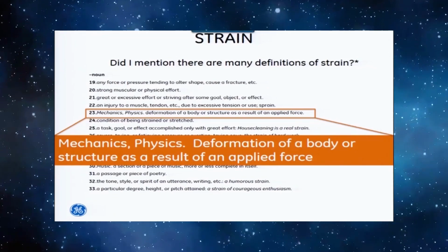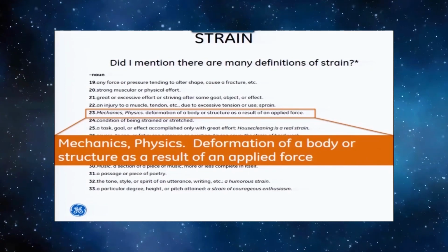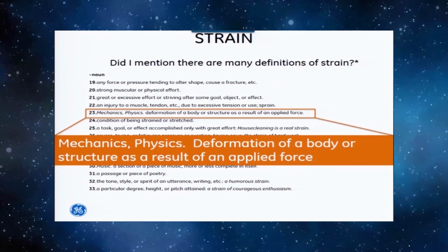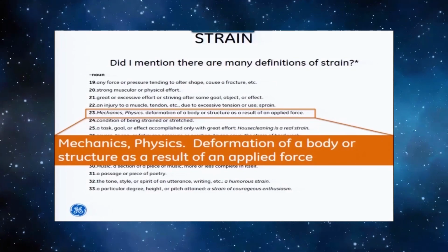So here's the thing. When the engineers first came to me with this definition many years ago, I looked at them and said, can I have a definition for this definition? So we are going to define exactly what this means.